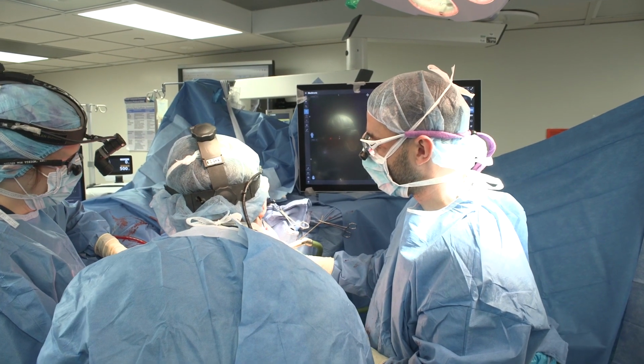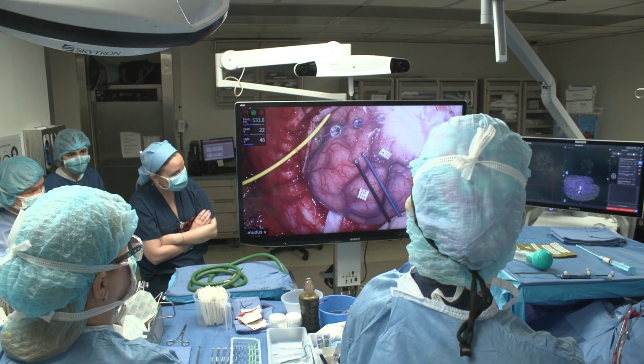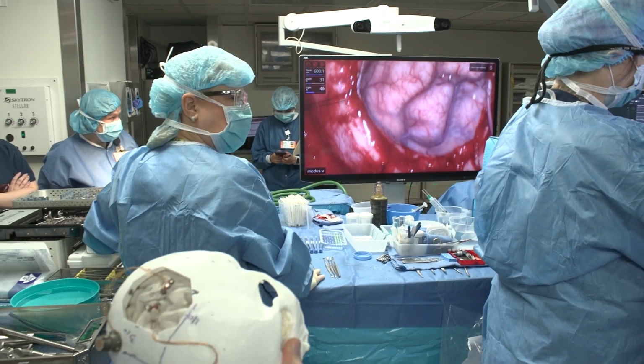After opening the skull and opening the cover of the brain, we then got out a stimulator. We had a pretty good idea where the hand areas were going to be, and we stimulated them directly. You feel the thumb? It's in the thumb? Yeah. So I placed it right over one area, and he said, I feel my thumb. I said, what part of your thumb? He said, my thumb tip, the inside of my thumb tip. And I said, oh, we found it.